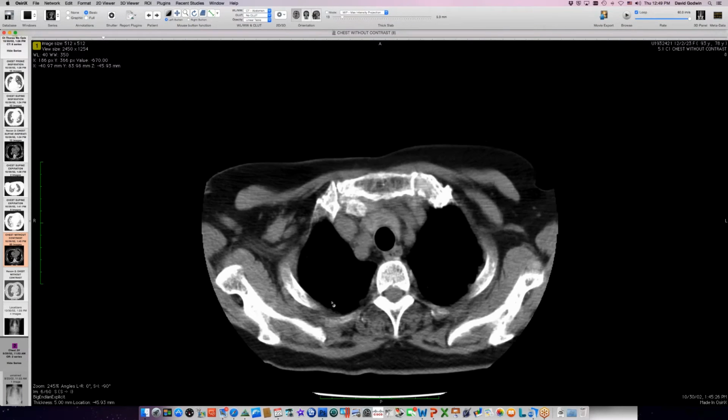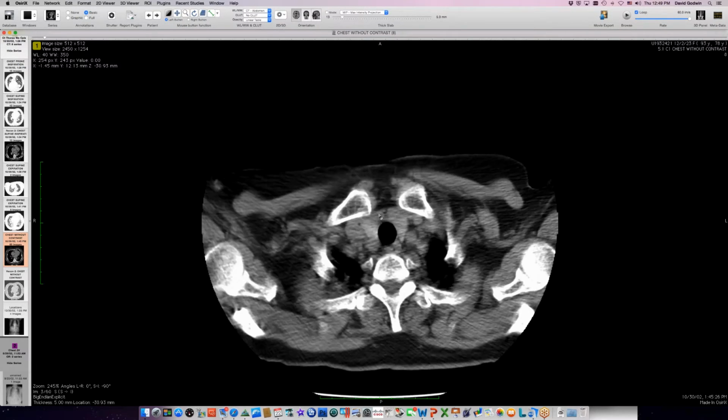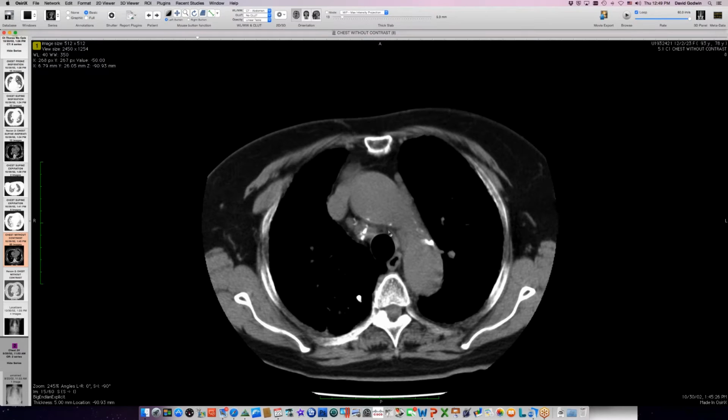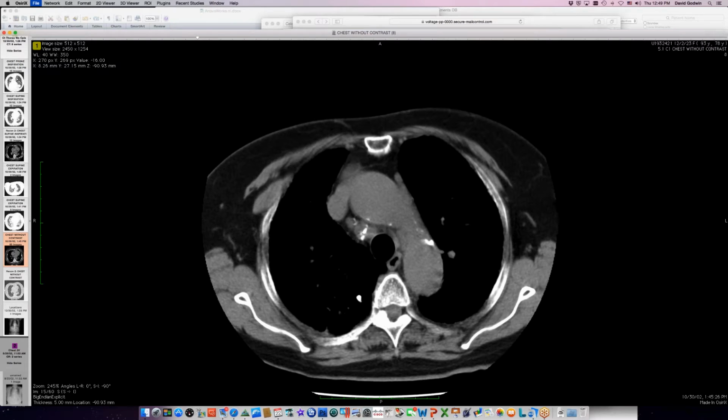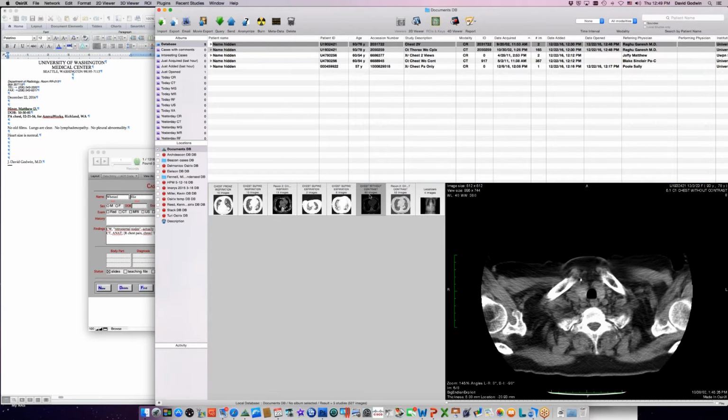Unfortunately, the CT scan of the chest doesn't go high enough in the neck, but we may be getting into one of those calcified nodes. So this would be calcified tuberculosis in the neck in the scrofula kind of distribution. There wasn't enough history to tell whether she'd ever had scrofula in terms of draining sinus tracts coming from her neck as part of her childhood TB. She was not a good historian, and she didn't speak English, so we don't have detailed history. But a lot of neck calcification, and she also had one, I forgot to show you, she has one splenic calcification.